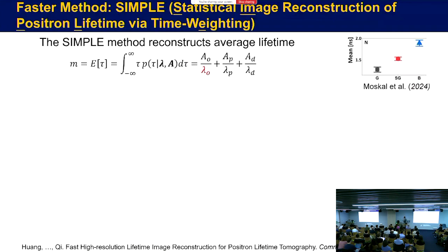But the reconstruction still takes time. It takes 50 frames to reconstruct and then to do the fitting. So it's time consuming, just like doing pixel-wise kinetic modeling for the total body map. So we want to make it faster. This is another development.